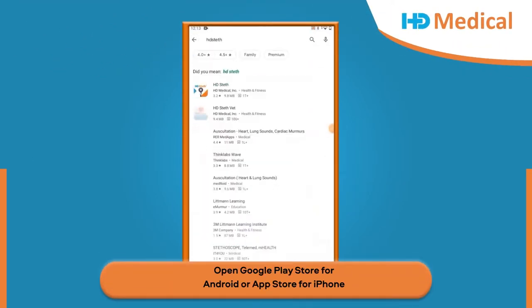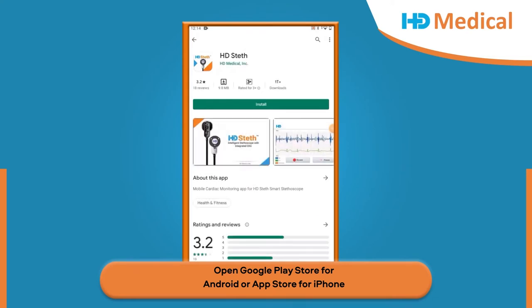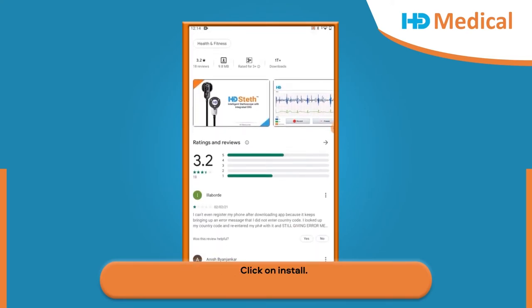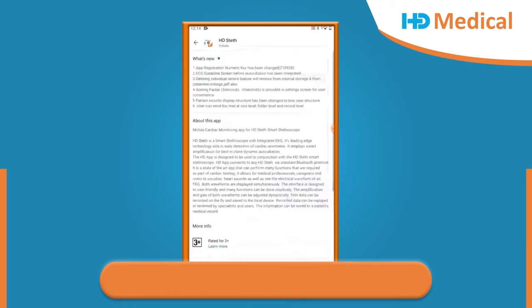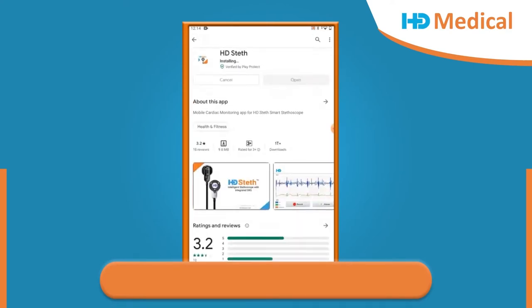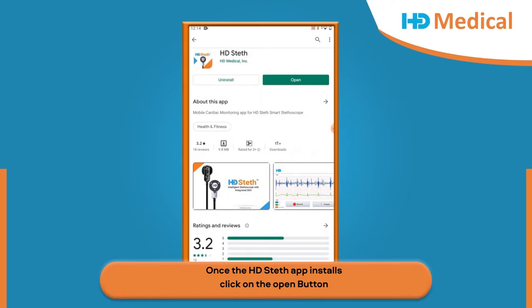Open Google Play Store for Android or App Store for iPhone. Search for HD Steth app. Click on Install. Once the HD Steth app installs, click on the Open button.